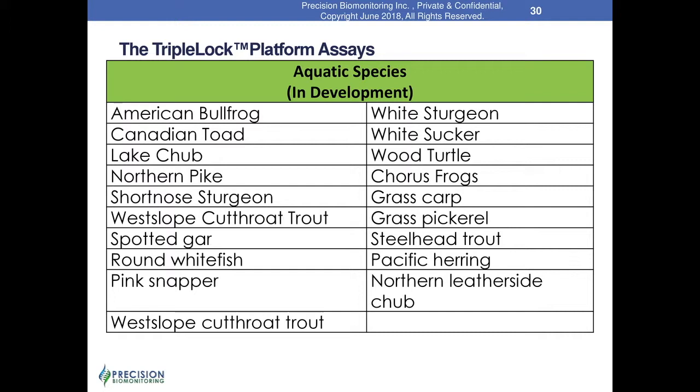That's a good question. We haven't explicitly looked at that because when we apply our on-site eDNA detection, we purposefully try and avoid getting in the streams and any other water body. The Andy eDNA sampler does come with an extendable boom that extends up to 3.6 meters, I do believe. And at the end of the boom, we have a single-use sampling tube that is completely sterile. It's the only part of the process that will touch the water and penetrate the water surface. So whilst your concern is valid, our approach entirely mitigates against actually disturbing the habitat in such a fashion.